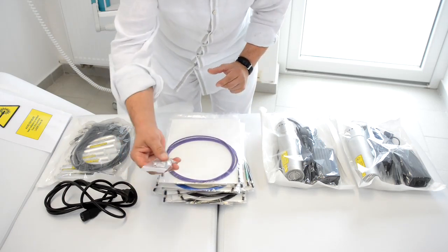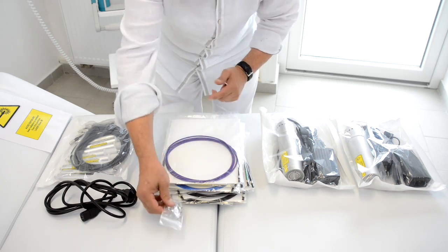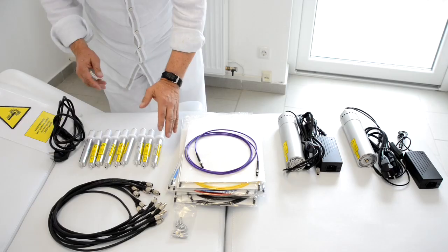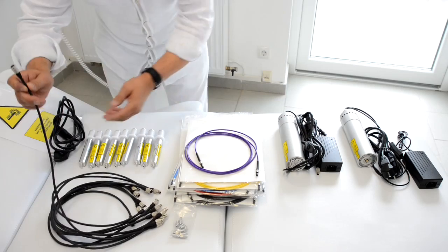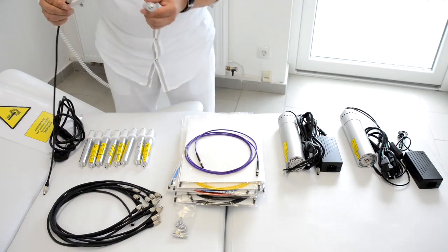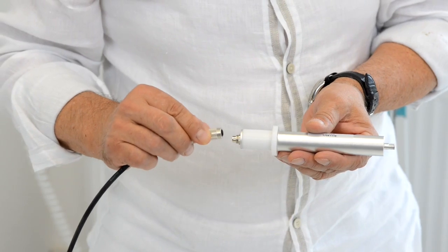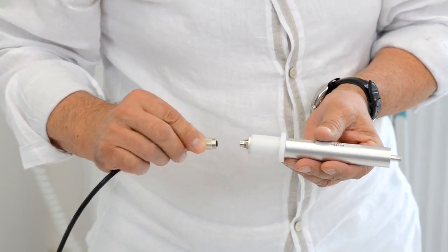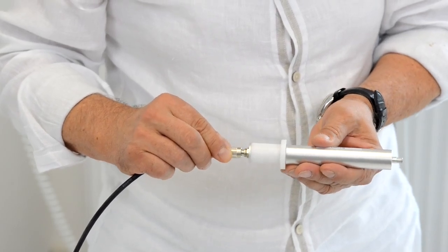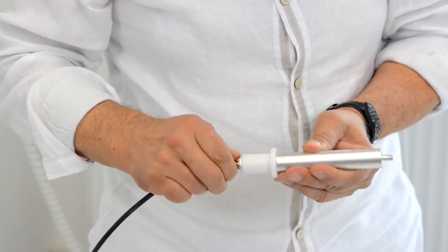Also here you see the small connectors with which we can connect the fiber optics for interstitial or intra-articular or intravenous therapy. So in the next step we have to connect the power supply cables to the laser model. So this is a green laser model and you have to connect the cable very carefully, not with much pressure. So first of all you set it here, you turn slowly and then it's going inside and then you can fix it by turning.